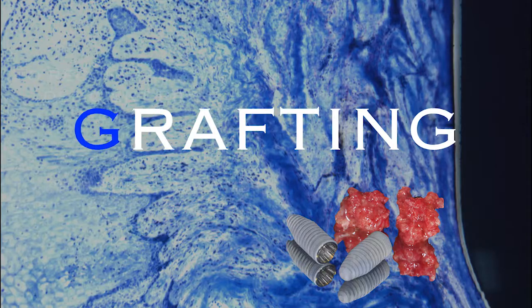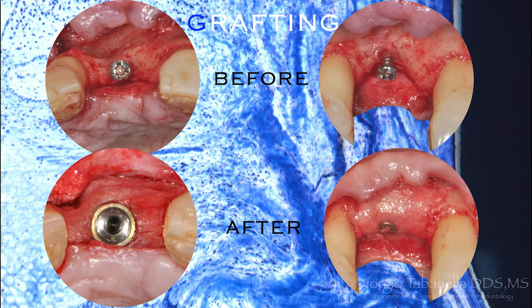Going back to grafting, because we're focusing just on grafting cases, that's an example of a block graft failure, an implant also that failed. So this patient came to me with this vertical discrepancy. If we don't graft, we're going to have uneven free gingival margin between the two central incisors.